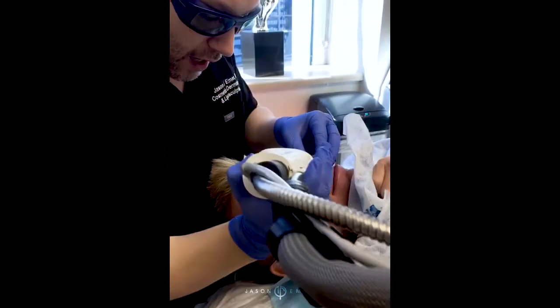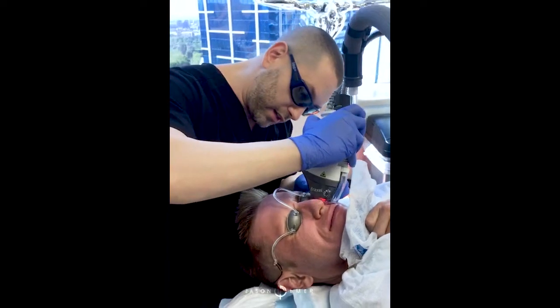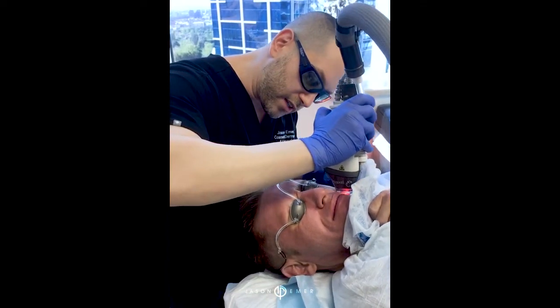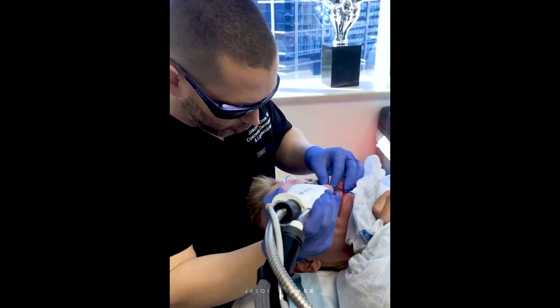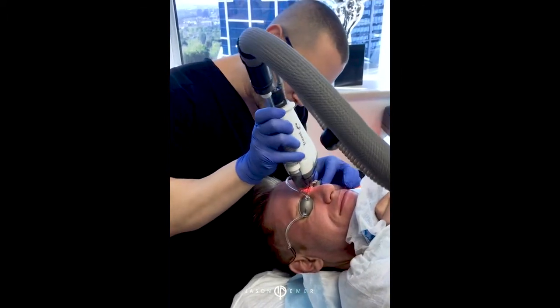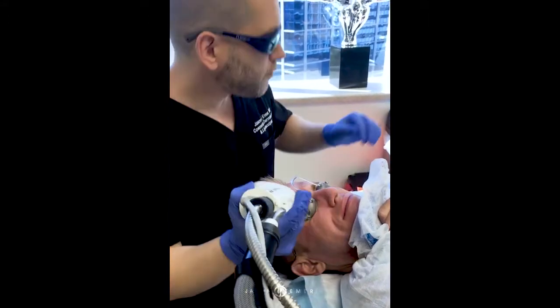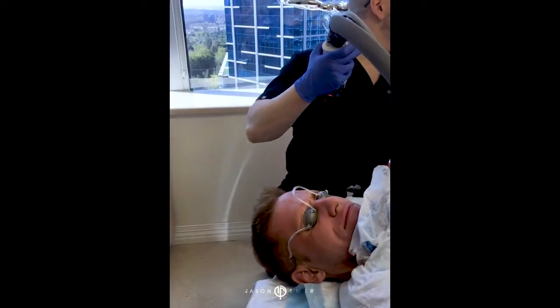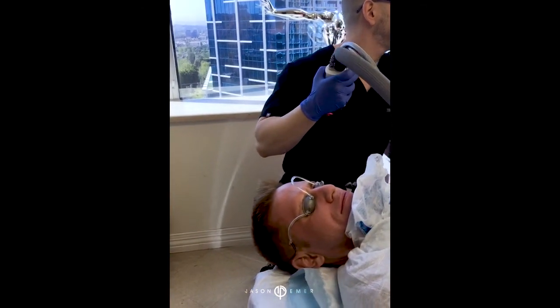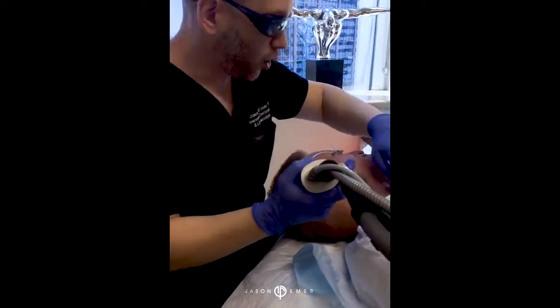And this also, guys that have thick skin, that have a lot of porous skin, that get a lot of acne or easily get lines and wrinkles, this will help prevent that. What the important thing I want to show you is that we also will treat the neck, because we don't just want the face. You get sun damage elsewhere as well. So we're going to turn your head all the way to the left. We're going to also treat the neck.